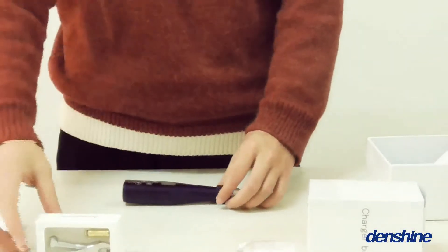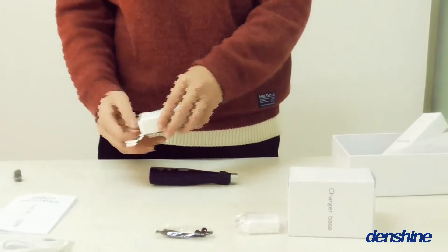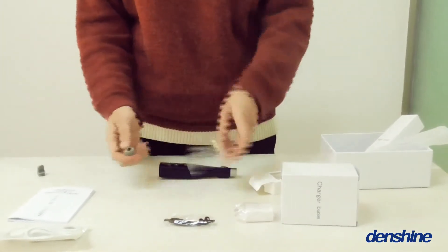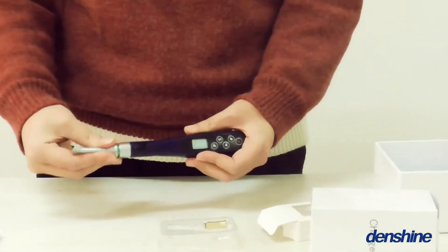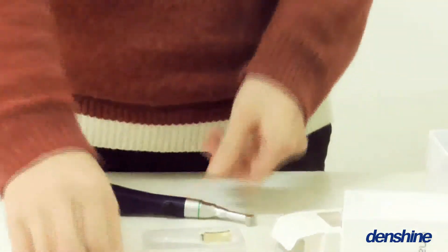Secondly, the design. Environmental plastic handle, exquisite design, comfortable touch, and ergonomic using.